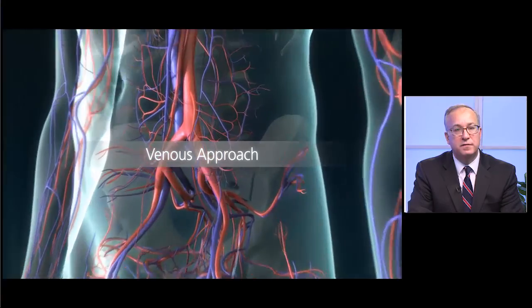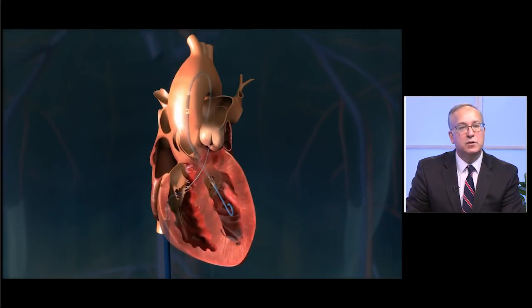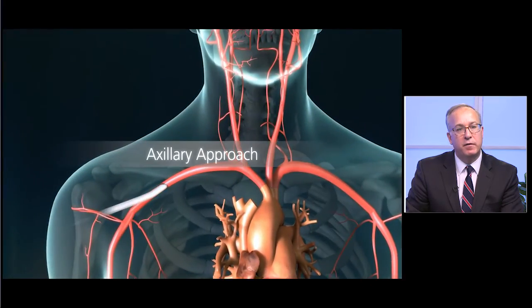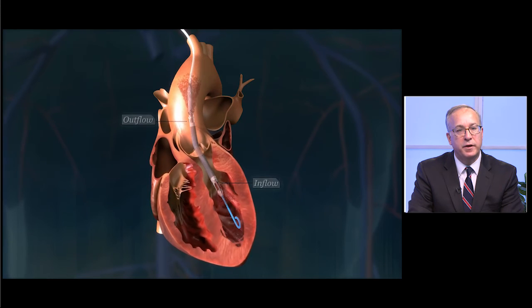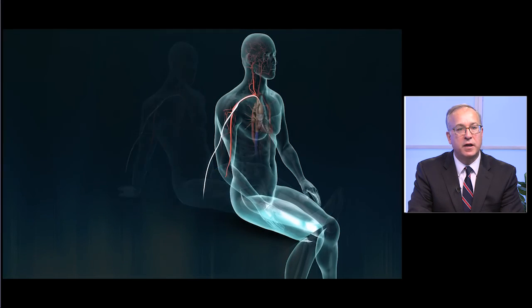Immediate improvement of these factors is the goal of both medical and mechanical therapies. Achieving these goals through improved cardiac output and the potential benefits that may result from avoidance or reduced inotropic and vasopressor therapy are beneficial effects of Impella use in cardiogenic shock.